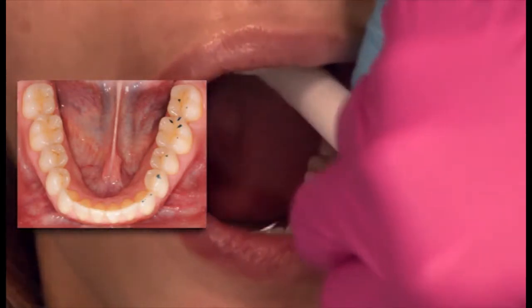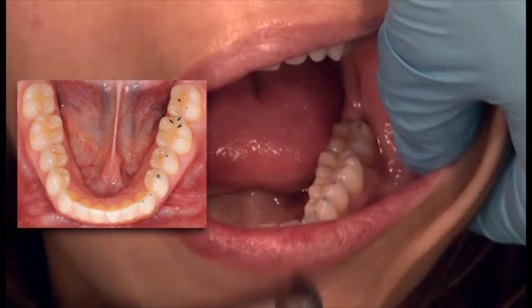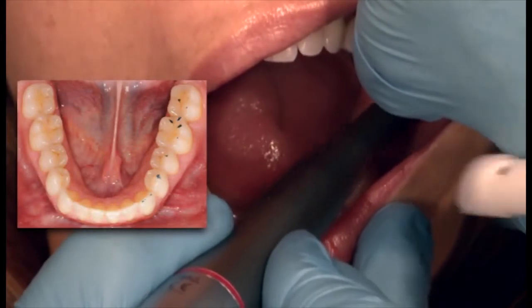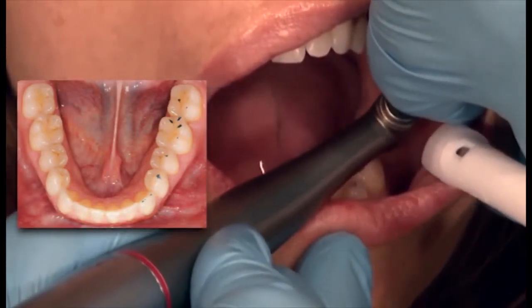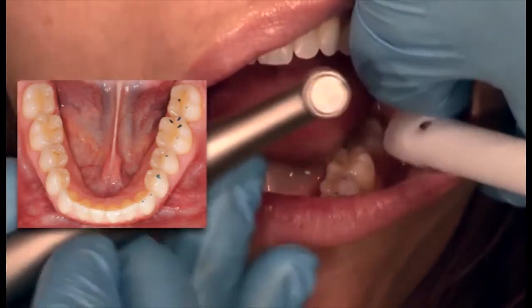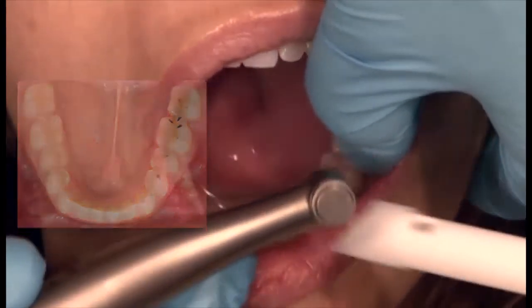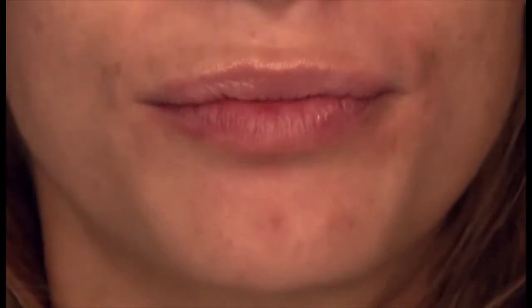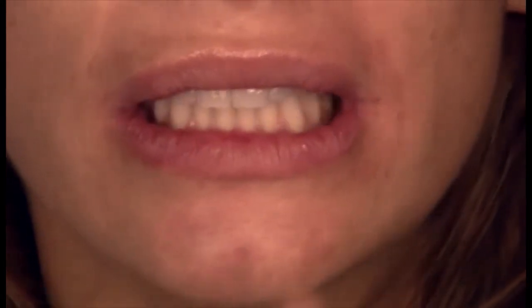On that second molar, there's a bit of a dangerous one on the inner incline of this particular cusp. Second molars I don't want in any pre-contact. So I'm going to take that away. Anything on an incline that could skid the jaw. And now ask the patient, tap up and down. How does that feel? Very good. But still. Very good? Not the right answer.